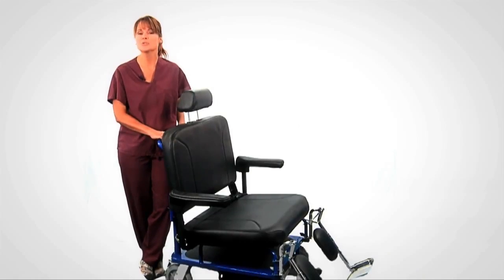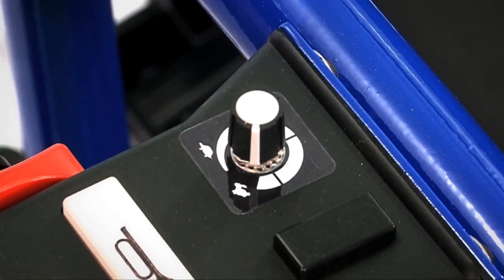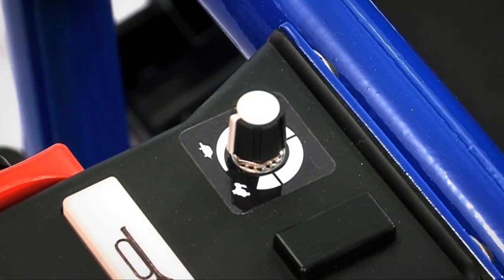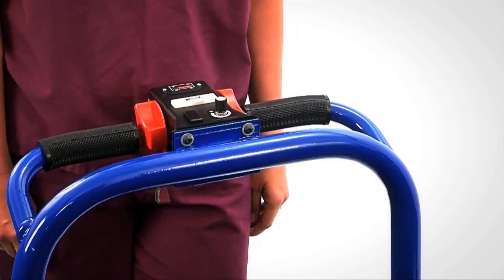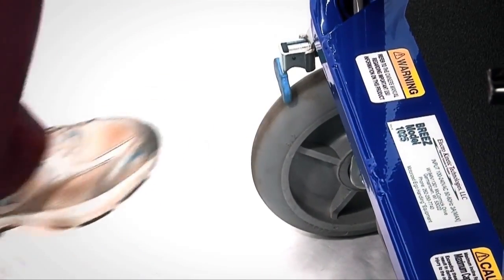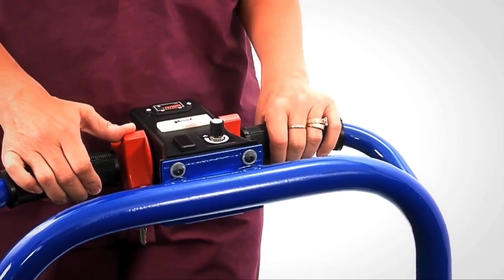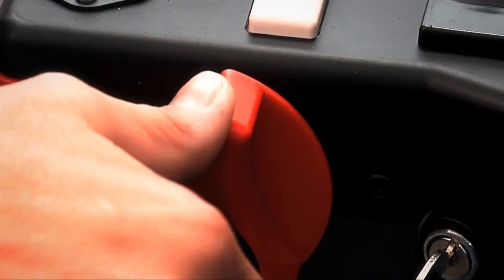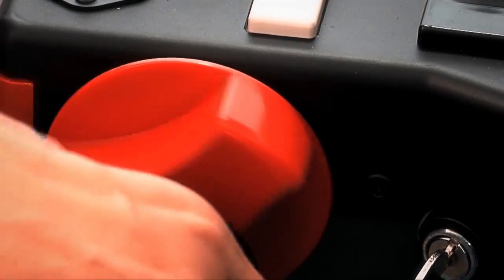When operating in close quarters or if you are new to driving the Breeze, we recommend that you set the speed to the turtle setting by turning the dial completely counter-clockwise. To drive the Breeze, start by placing both hands on the steering bars. Release the brakes on both rear casters by moving the locks down. Place one of your thumbs on either the left or right accelerator. You don't need to use both. Move forward by pressing the speed control toward the patient, and move backward by pressing the speed control down away from the patient. The speed control has a factory programmed delay and acceleration profile to ensure safe and measured acceleration.